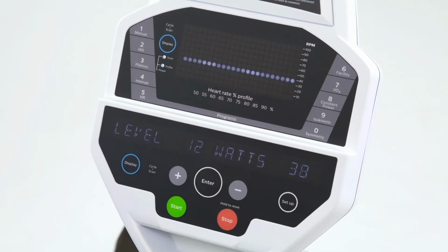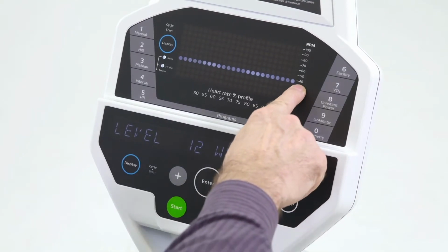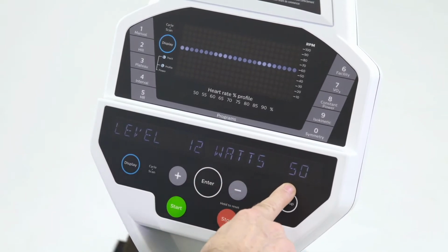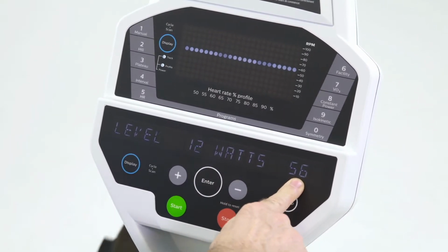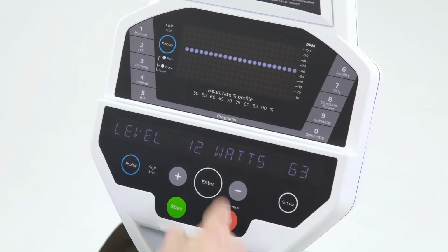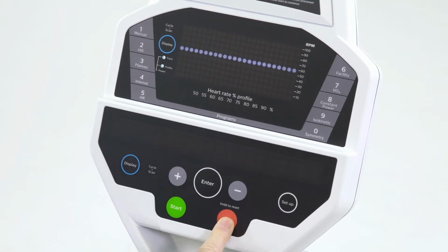Now I'm higher, so it's 4 rows of lights. That's 40 watts, and you can sort of see on the scale there, it's showing 40. I'm at 60, which actually takes a little while to catch up to the power that I am putting out. So you have a visual feedback of the amount of power that you're pedaling at.